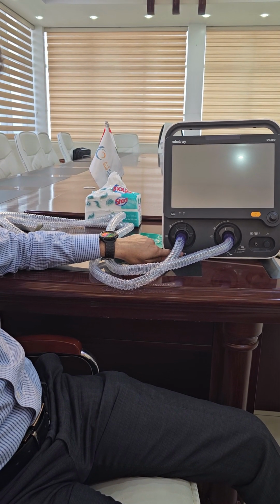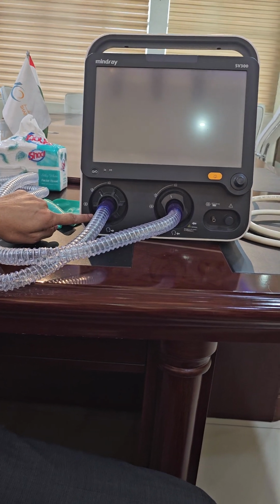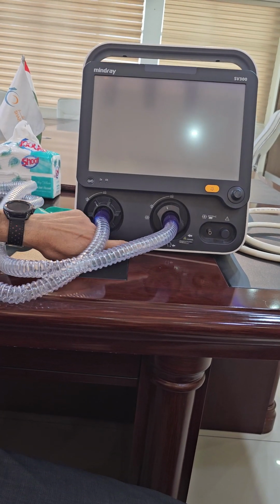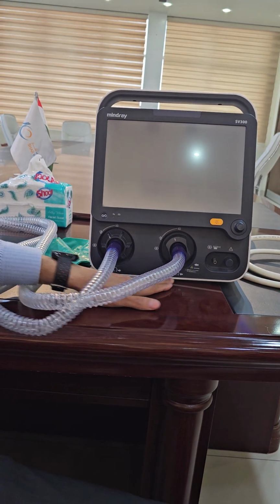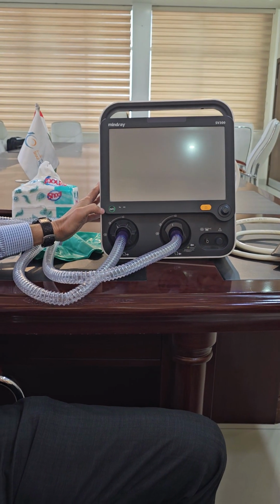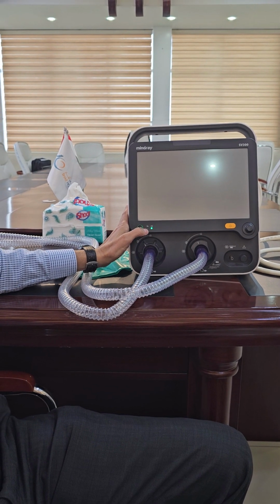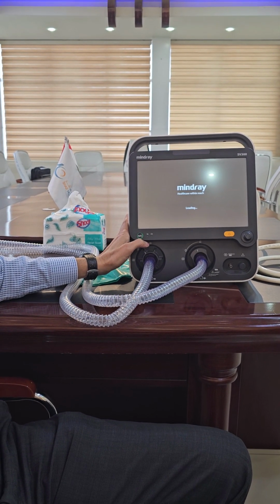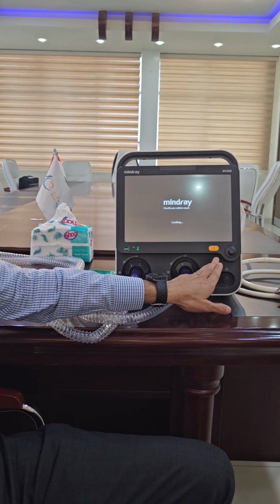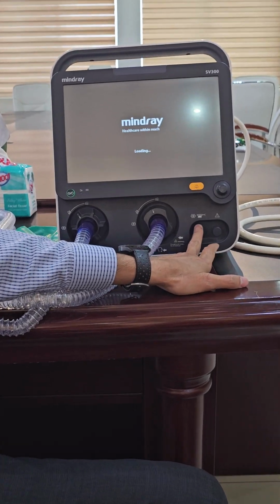This one has the exhalation valve, and this one has the inhalation valve. Going and coming. Did you see? And this is our on switch. It says that it's on the battery, not on the DC. And this is the alarm. This is for nebulization, if you want to give anything to the baby.